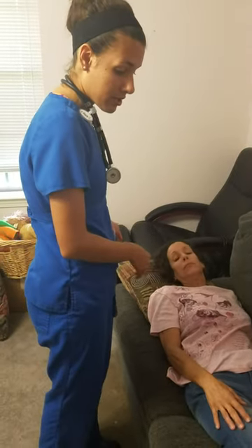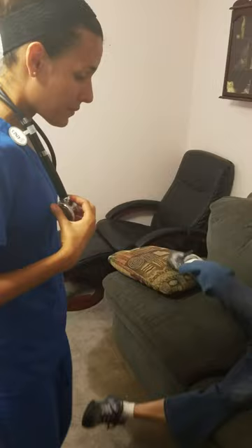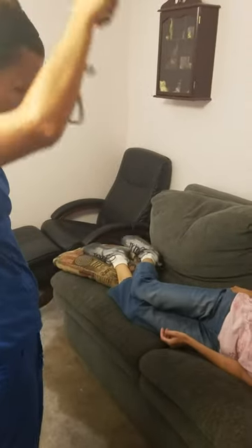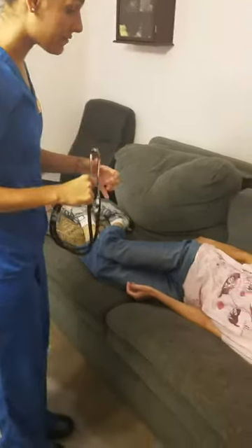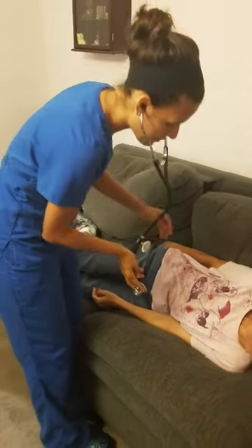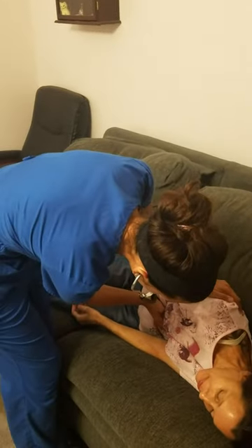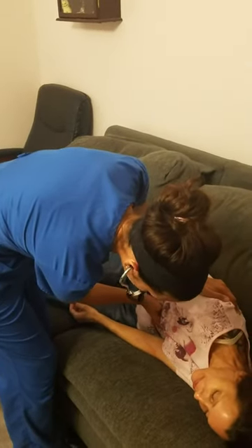I'm going to have you go ahead and lay to your left side so I can make sure I only hear S1 and S2 sounds. Sometimes you can hear S3 and S4 in this position that you didn't hear while supine. I'm going to use the diaphragm of the stethoscope at the apex of your heart. Roll a little bit more. And I only hear S1 and S2 — no S3 or S4 sounds.